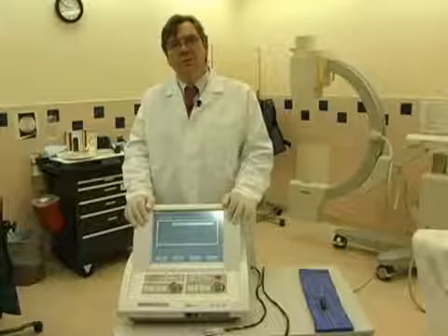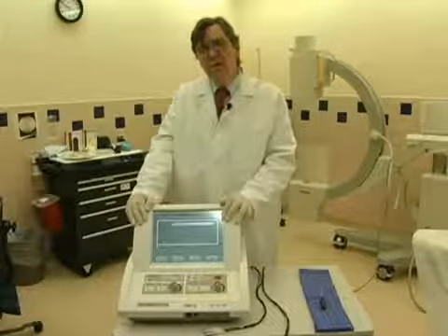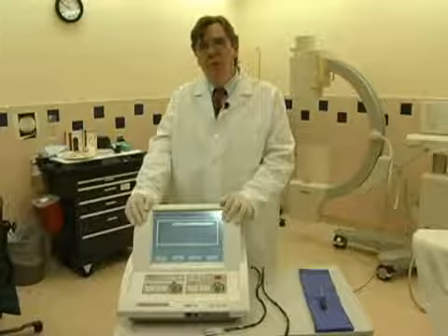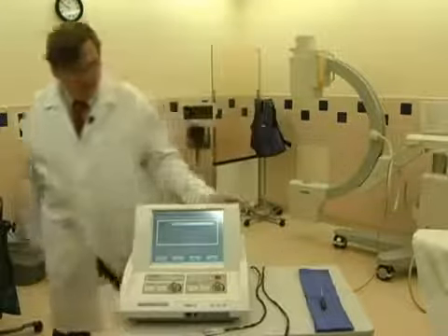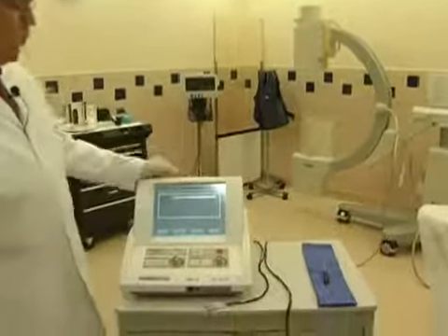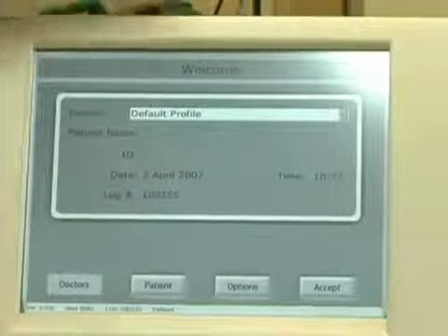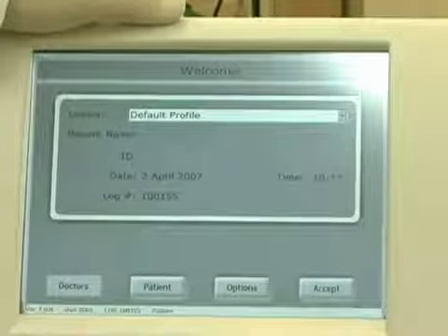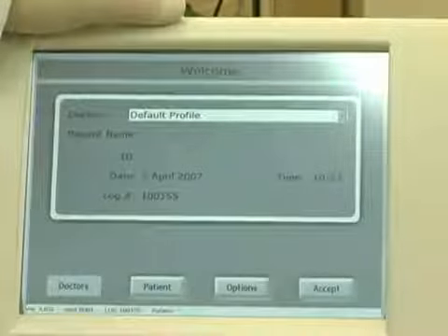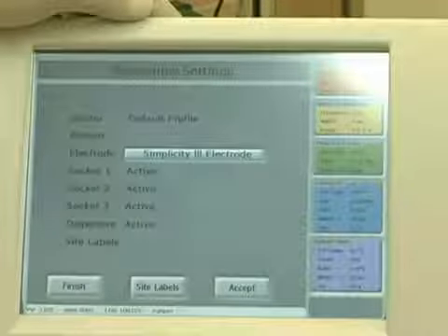Now that we've seen the placement of the Simplicity probe, I'd like to demonstrate the operation of the NT1100 RF system, which is required for the use with the Simplicity probe. When the NT1100 is powered on, the welcome screen is entered. The welcome screen gives you several options, including the ability to enter patient data, the ability to enter doctor preferences, and other options such as setting electrical parameters or the time and date. Upon hitting accept, the procedure settings screen is entered.